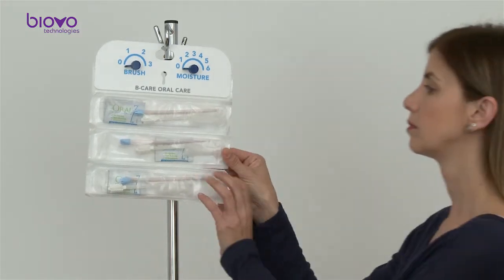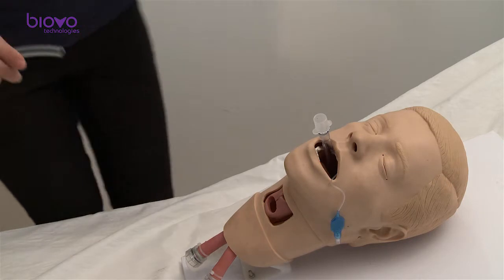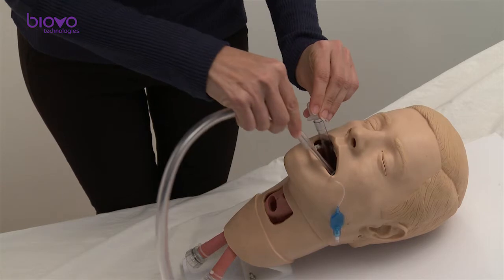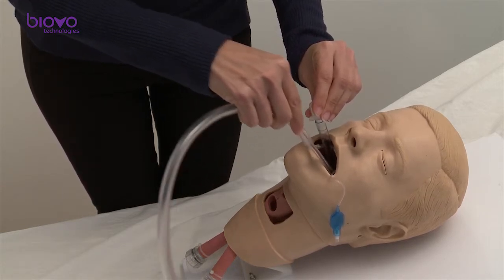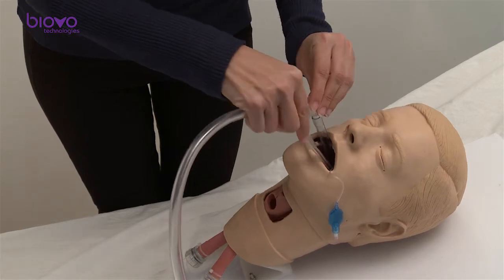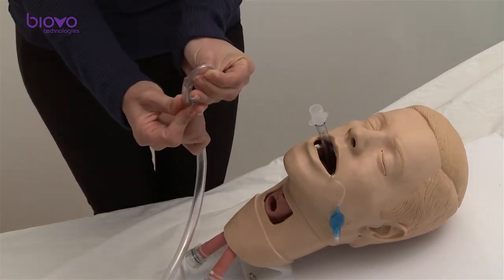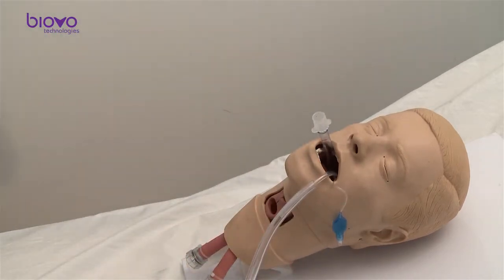To start, tear a set of tools from the board. Take out the suction rod and connect it to the suction line. The suction catheter can be used to remove secretions from the oropharyngeal area. For convenience, the suction rod may be bent and hung for continuous suction on the mouth of the patient.